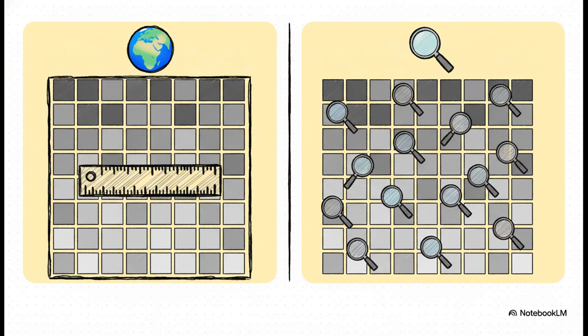This slide just nails the difference perfectly. On the left, global thresholding, one rigid rule for everything. On the right, adaptive thresholding, a flexible, local rule for each tiny part of the image. That is the key insight that's going to solve our problem.